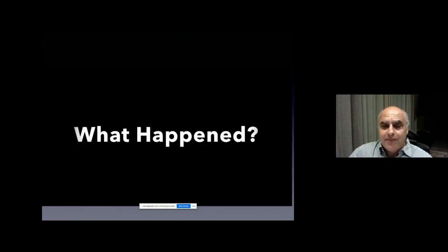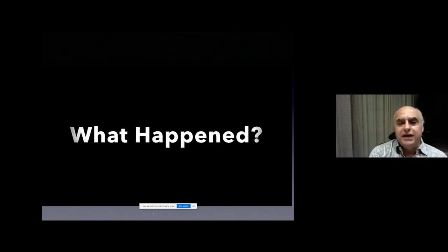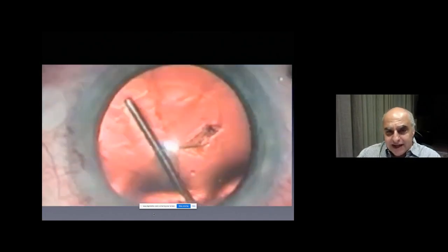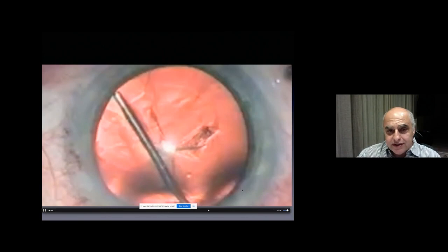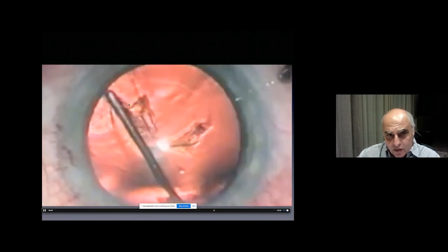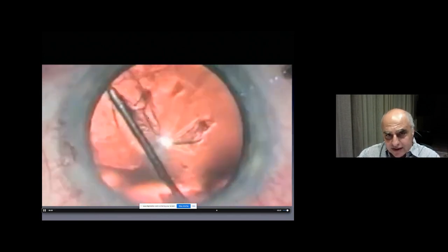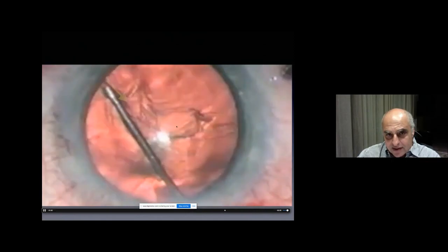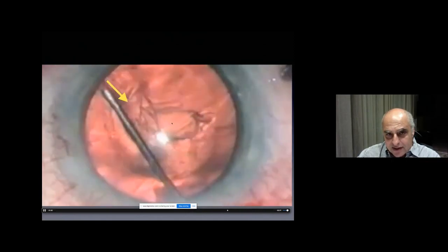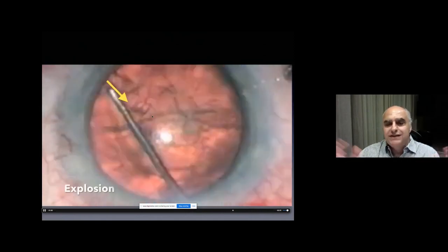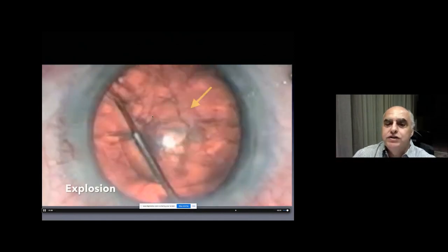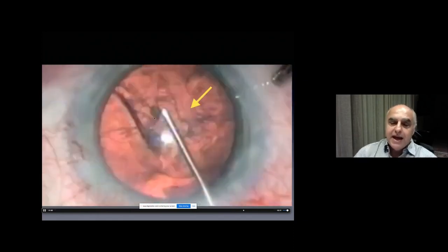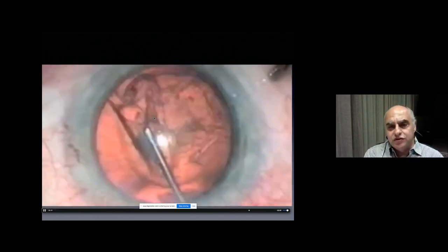So what happened? Look here — you will see like an explosion in the center. This is the wave. This is in slow motion. See? It's like an explosion. And this is called capsular block syndrome.